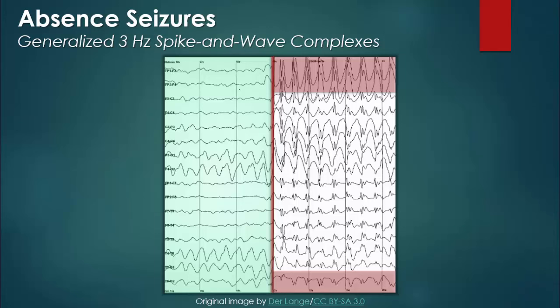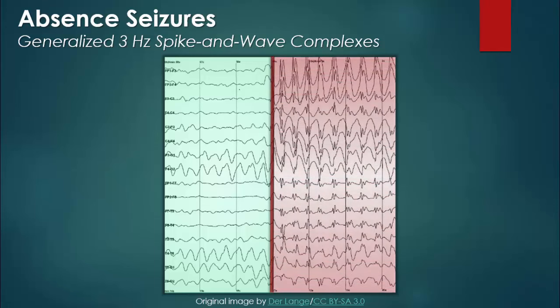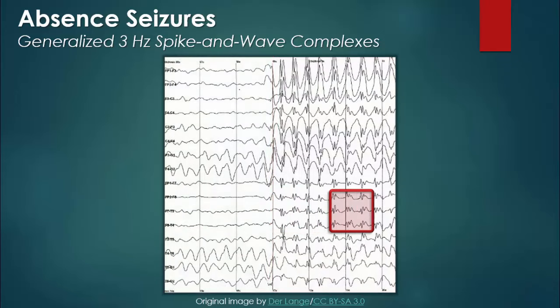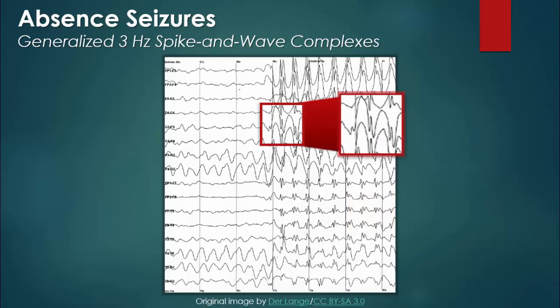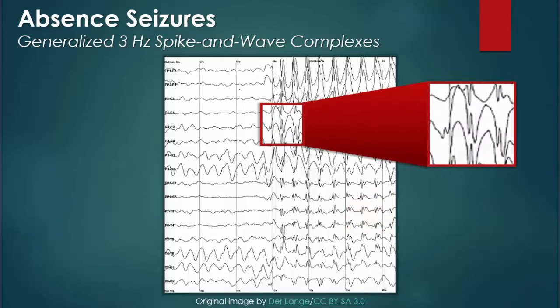After inspecting the EEG from top to bottom, we note that the discharges occur in every lead — in other words, the epileptic activity is generalized. When following a lead from the start of the epileptic discharges to the end of the EEG, a repeating pattern becomes evident. With a closer look, we can see that each of the repeating complexes consists of a spike and a wave.